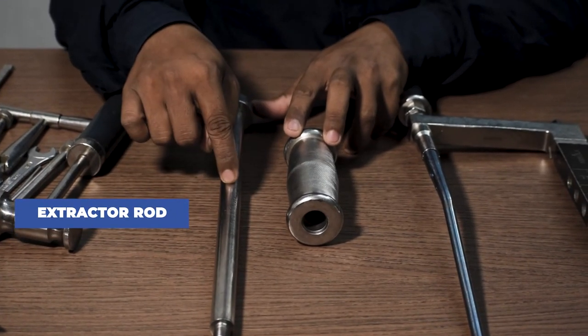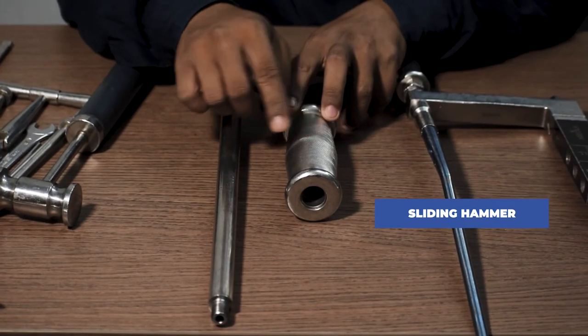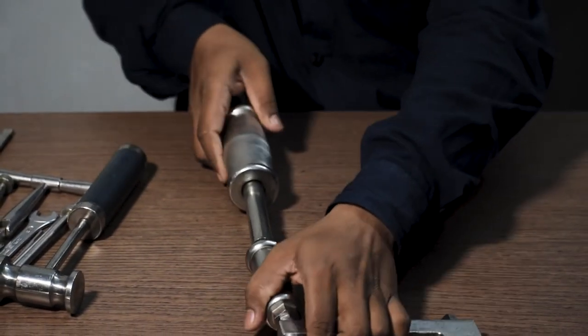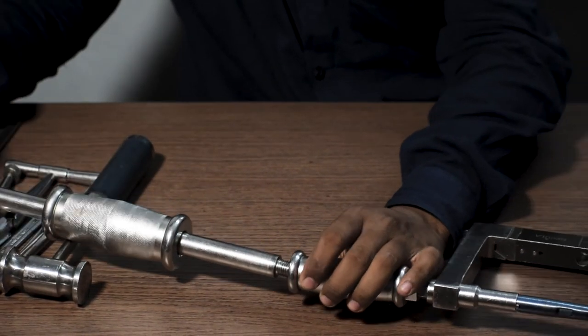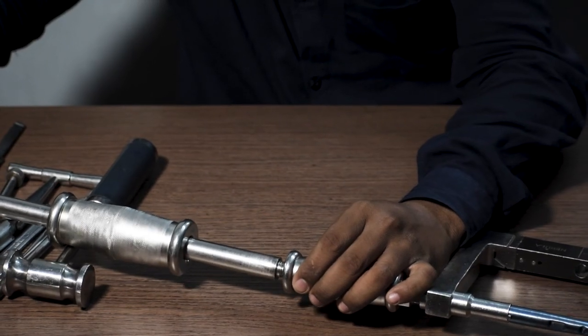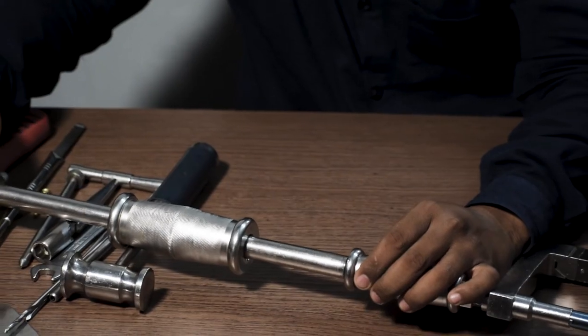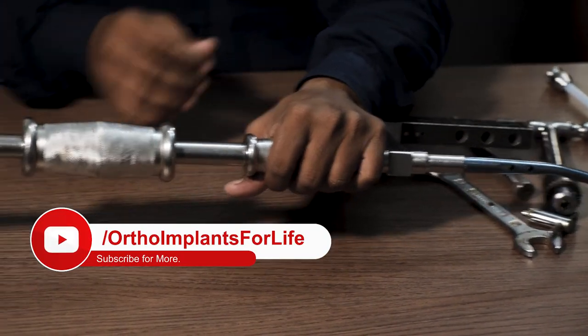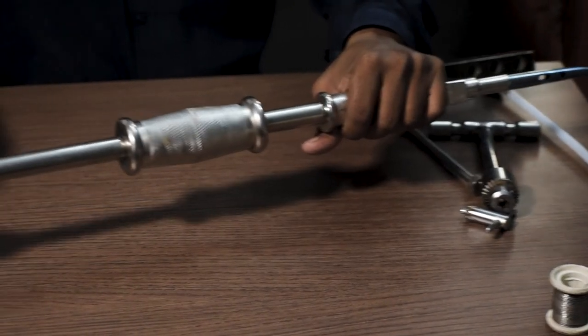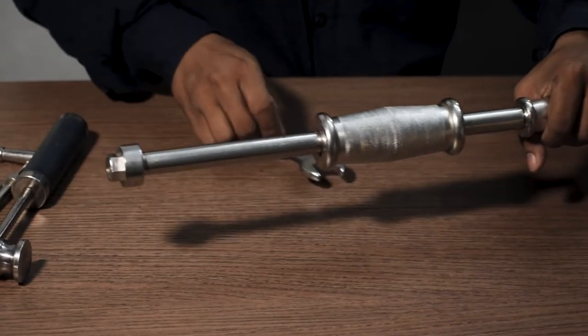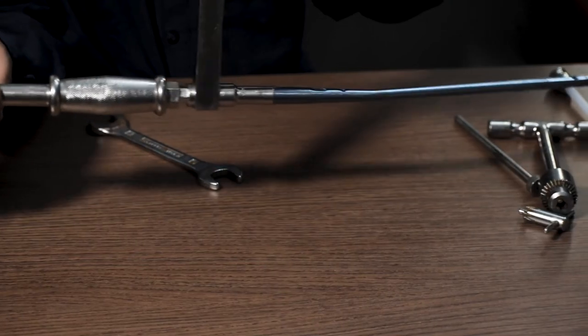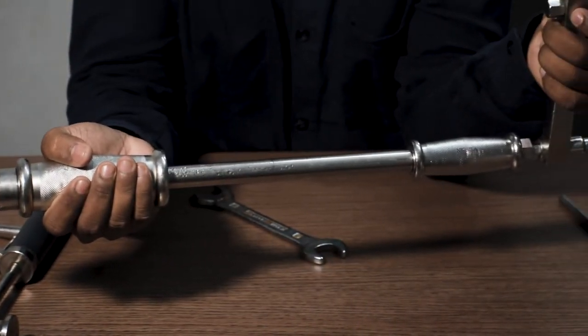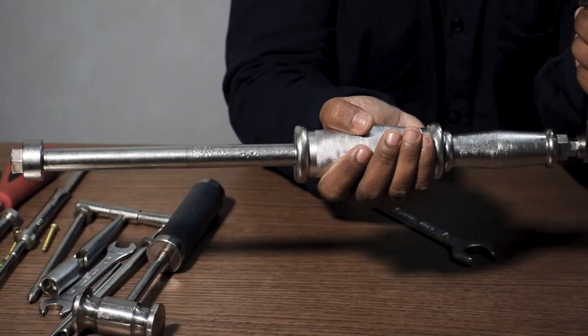This is an attachment which you can use by fixing it with the hammering adapter like this, and further tightening is done here with the help of a spanner. This is used for back hammering to do extraction or to impact for the insertion of the nail.